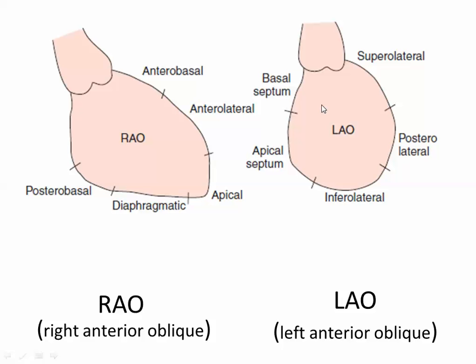It's the short axis of the heart. Okay? Short axis. Where is the RV in the short axis? Here. Yes? So the RV will be here. Okay? And this will be the atrioventricular sulcus, left and right. So the RCA will be here. If it is dominant, it will give the PDA. If not dominant, it will stop here. It's clear? Clear, alhamdulillah.